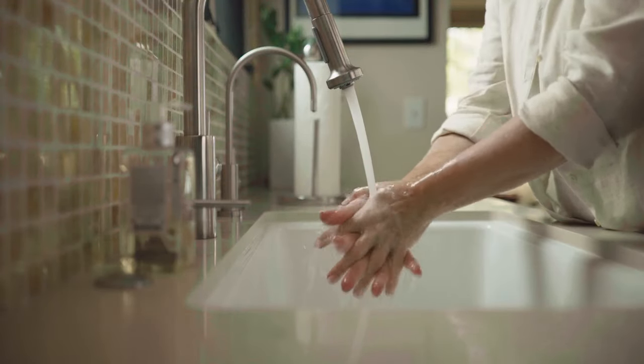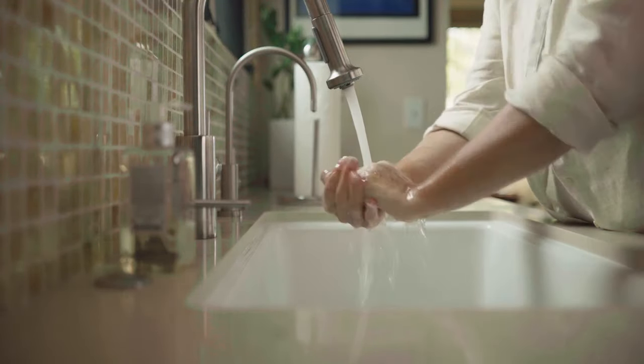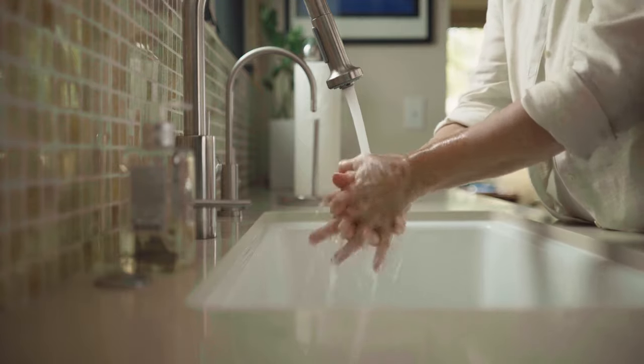After you've removed the dressing, wash your hands thoroughly with soap and water again for a full minute. Make sure you have a clean, clear area on a table or counter to serve as your workspace.